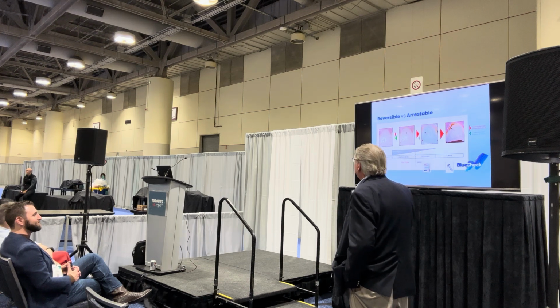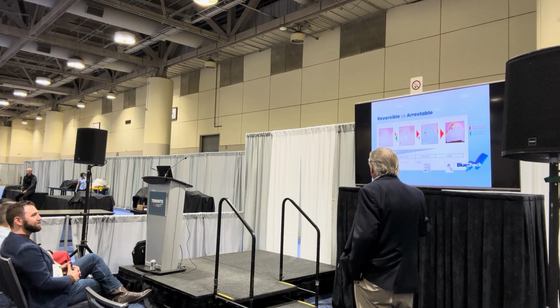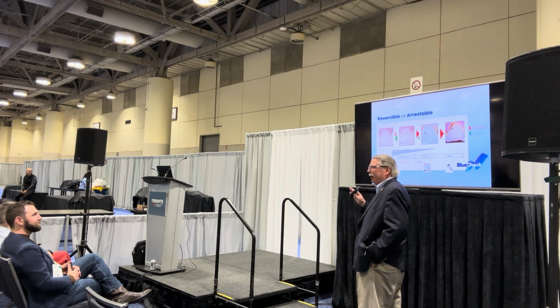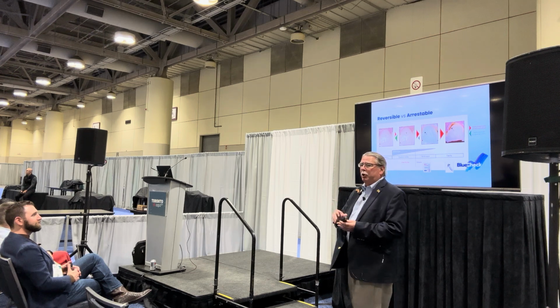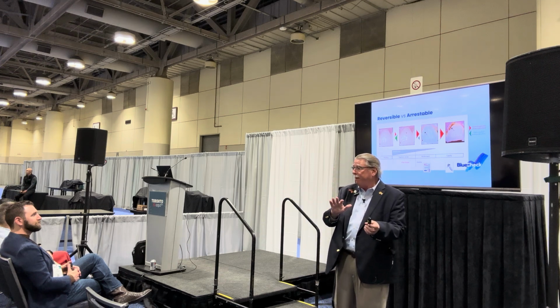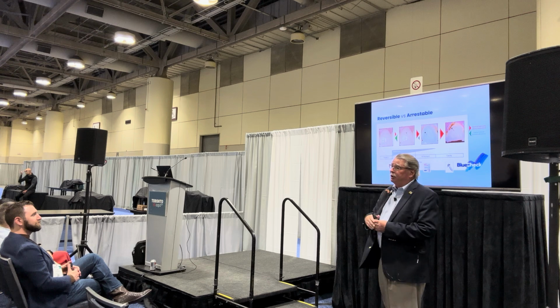But I think the thing that I wanted to make sure I did, and I hope I made this clear at the start, the whole idea when this was being developed was to diagnose early, not to do restorative. It was to follow the lesion. So, with our QLF, we could follow the lesion, sometimes at remin, you could see it, and you could follow D-min. The same thing's true with this BlueCheck.